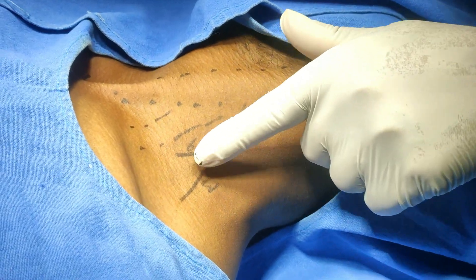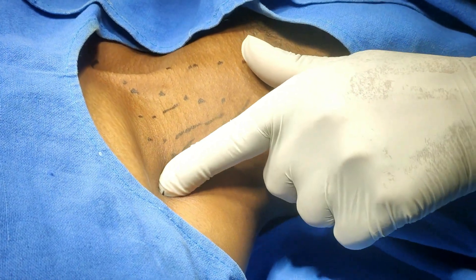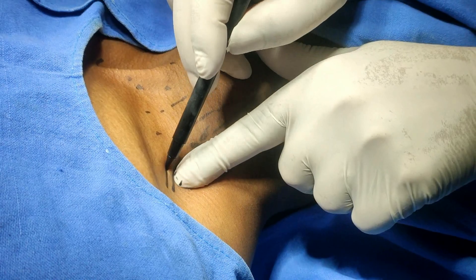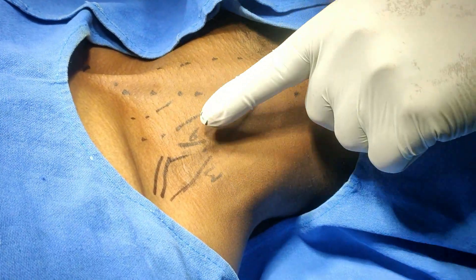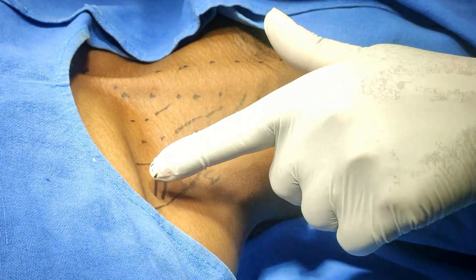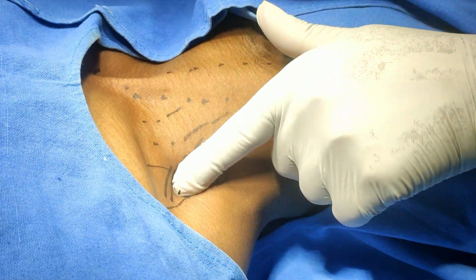If I roll the tip of my index finger down, I can feel an oblique structure, and this oblique structure represents the inferior belly of the omohyoid. So this is the interscalene cleft — a cleft between the scalenus anterior and scalenus medius. This triangle can be divided into two: one is above the omohyoid and one is below. We can block the brachial plexus by inserting the needle above or below the omohyoid.